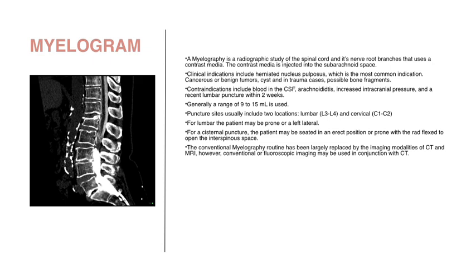A myelogram is a radiographic study of the spinal cord and its nerve root branches that uses a contrast medium. The contrast medium is injected into the subarachnoid space. Clinical indications include herniated nucleus pulposus, which is the most common indication, cancerous or benign tumors, cysts, and in trauma cases, possible bone fragments.